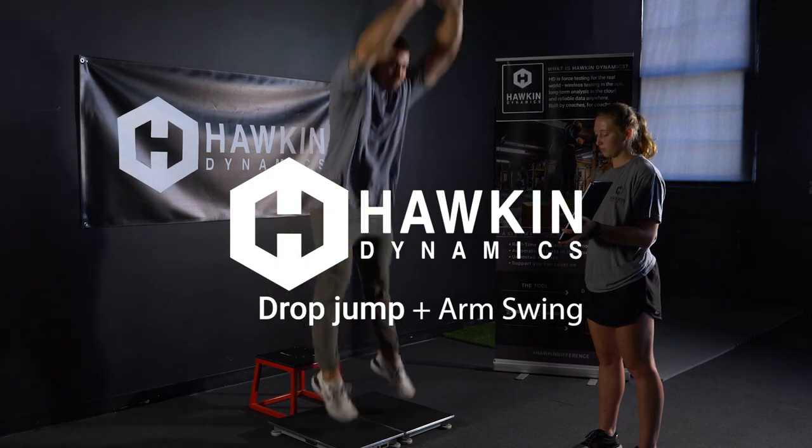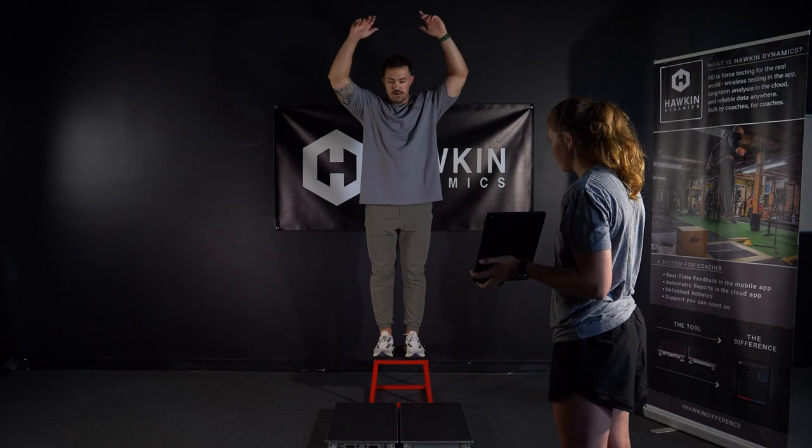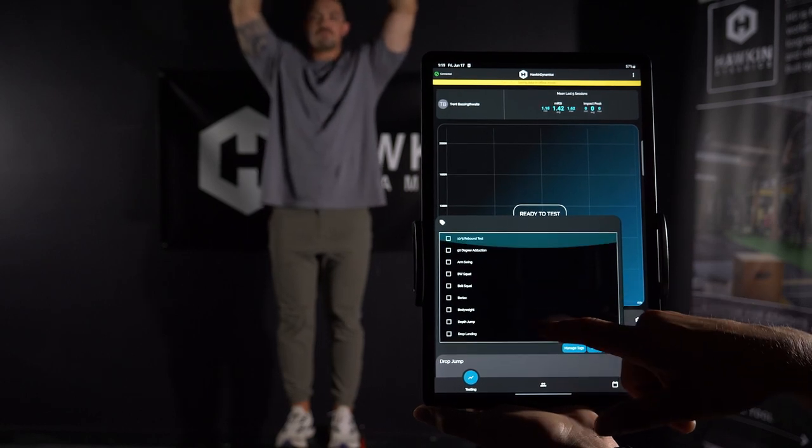In order to perform the drop jump with arm swing, have the selected athlete stand on the box directly behind the plates with their arms fully extended overhead. When the athlete is in position, select drop jump from the test options on the bottom of the screen. Tag it, arm swing.